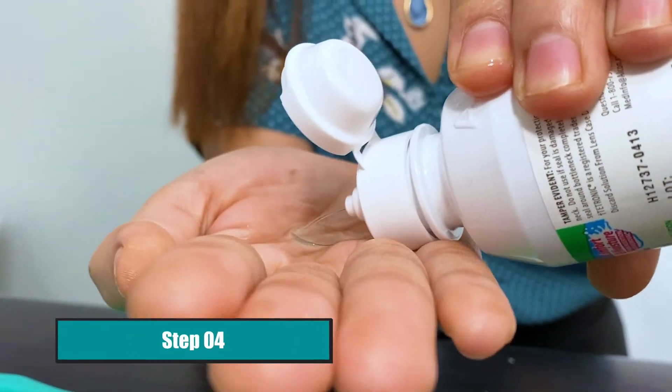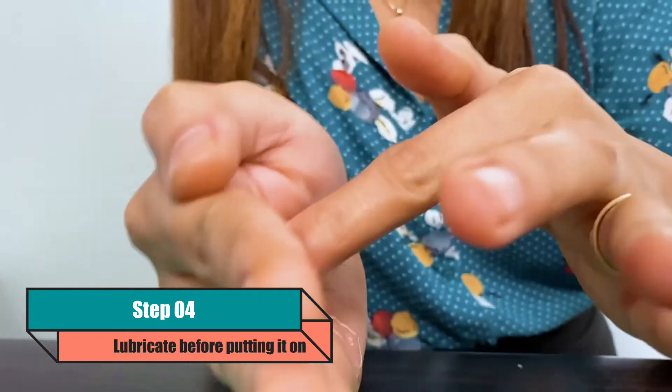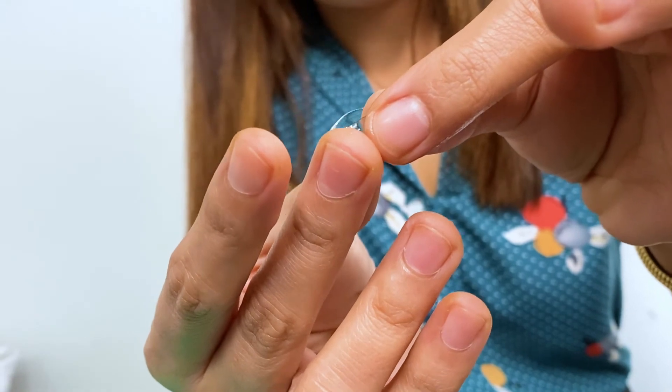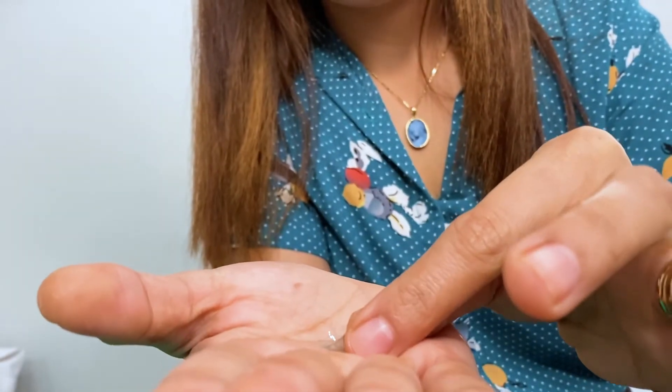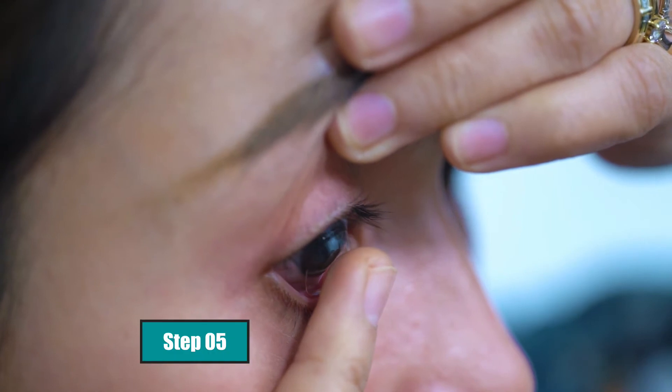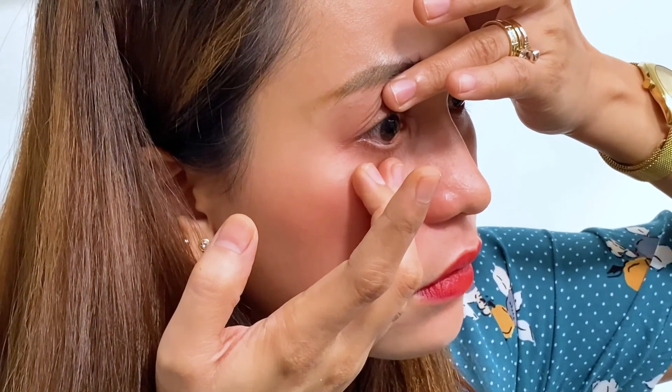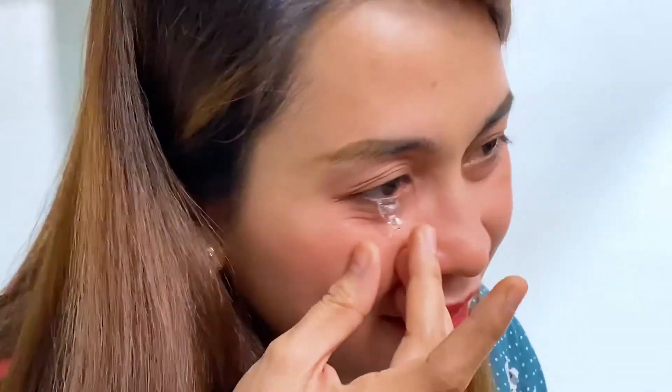Fourth, lubricate your contact lenses before putting them on. You can use your disinfectant solution or a lens lubricant — this makes it easier to fit the contacts on your cornea. Use both hands to control the eyelids. Don't be discouraged or frustrated if the contact lens falls off before attaching to the cornea; this is normal and happens even to long-time contact lens wearers. Once you wear your contact lenses, your vision might not clear immediately — let it settle down and it will clear up eventually.